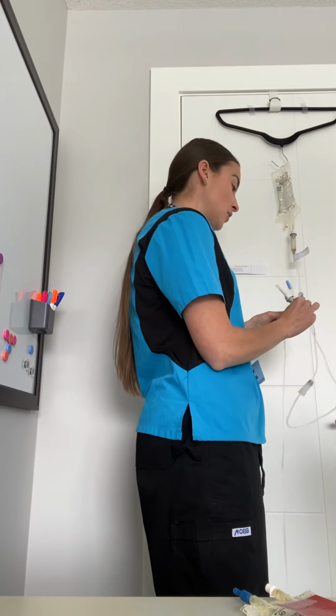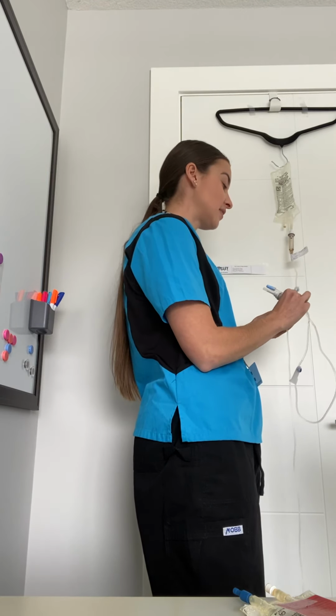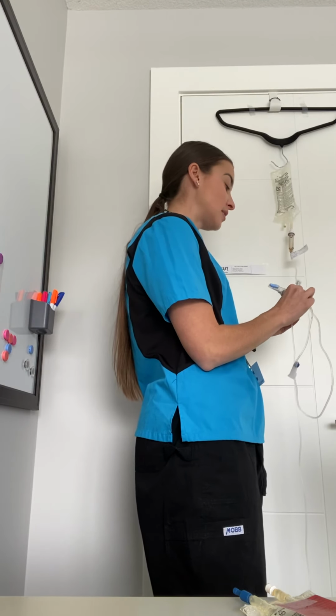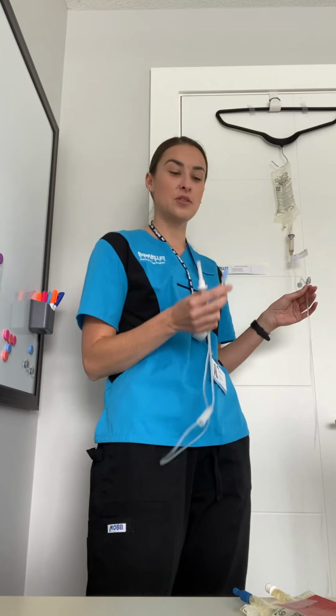So we're going to swab 1, 2, 3, 4, 5, 6, 7, 8, 9, 10, 11, 12, 13, 14, 15, 16, 17, 18, 19, 20, 21, 22, 23, 24, 25, 26, 27, 28, 29, 30. We also need to let that dry, so we're going to let it dry for about 10 seconds.